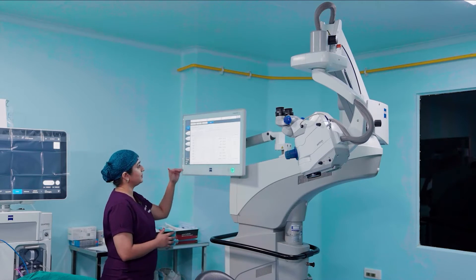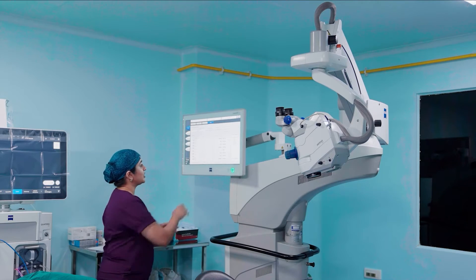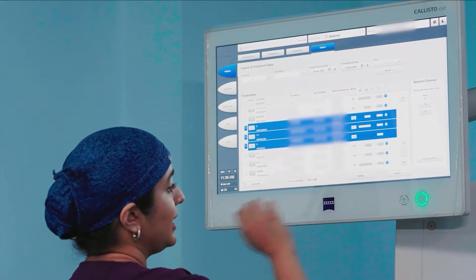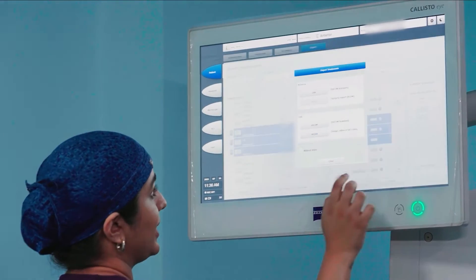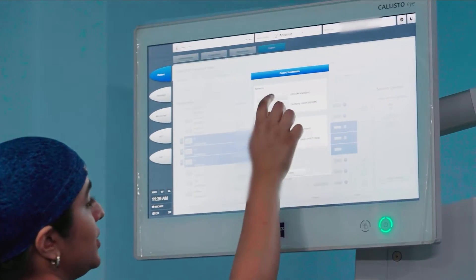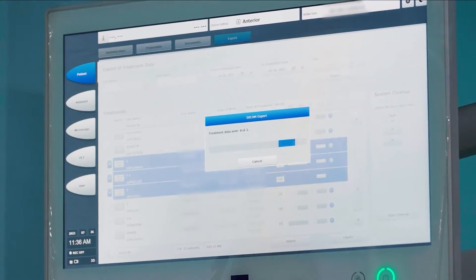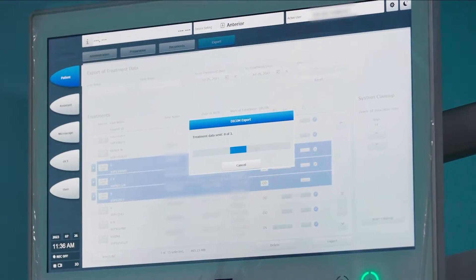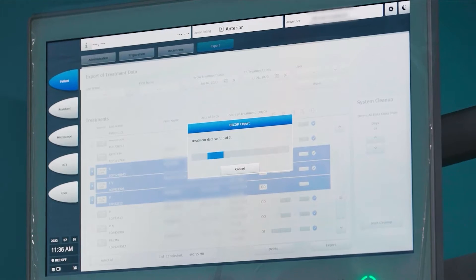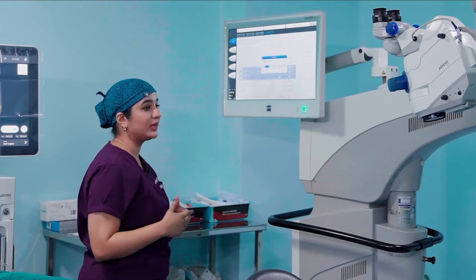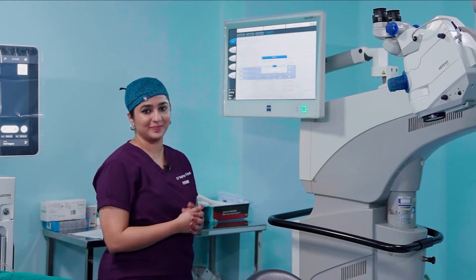This is the list of patients. We just select the patients that we need and export to LAN. It's just a click of a button and all the data is directly uploaded into the cloud.